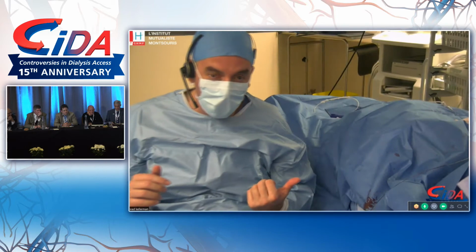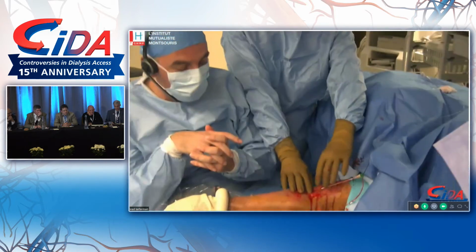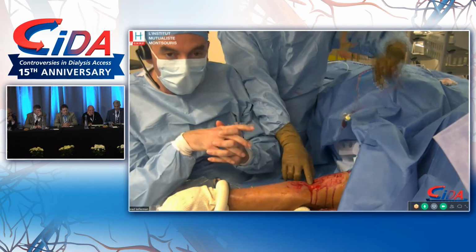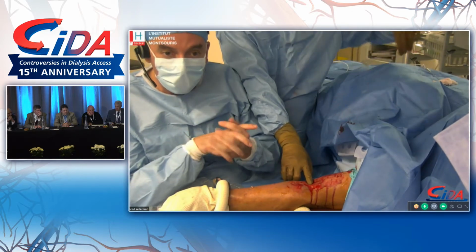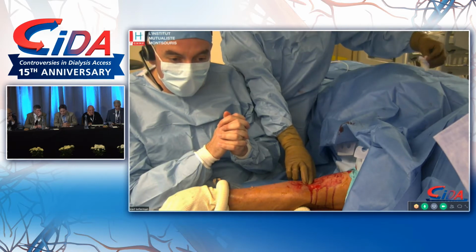My resident is going to hold some pressure now. You will see. We're going to take the sheath off, and we're going to hold some pressure a couple of minutes, and that's about it. Perfect. Somebody wanted to ask something? Eric? Hey, Alex, it's Eric Peden. That was really spectacular. It was really awesome.